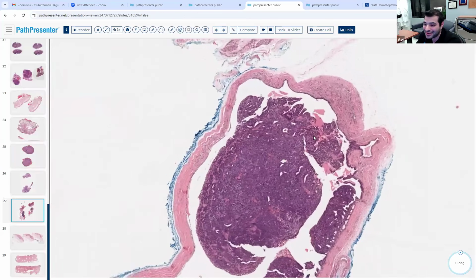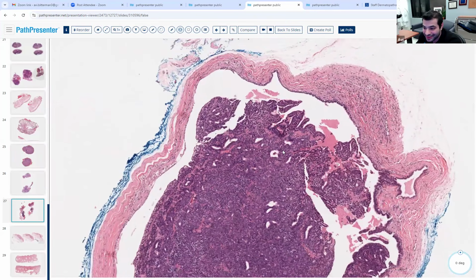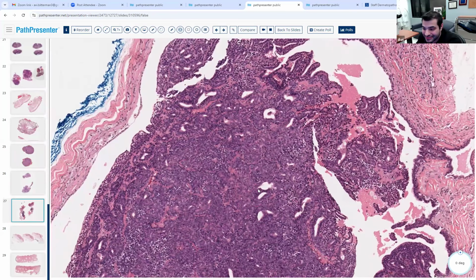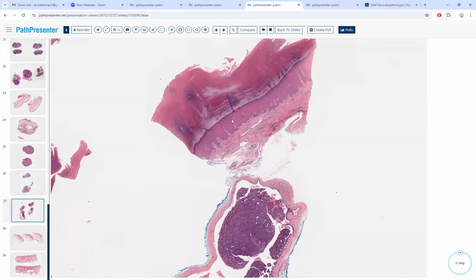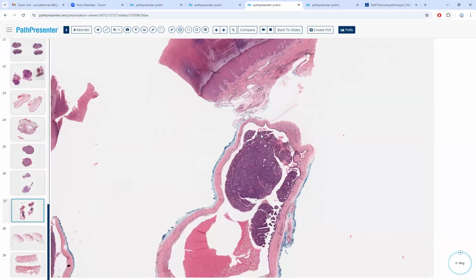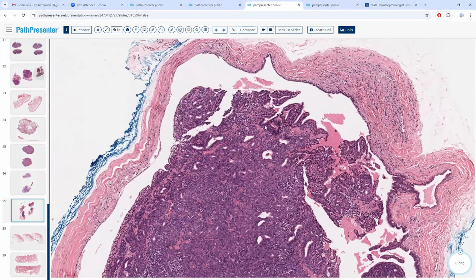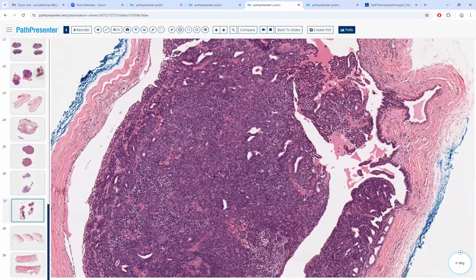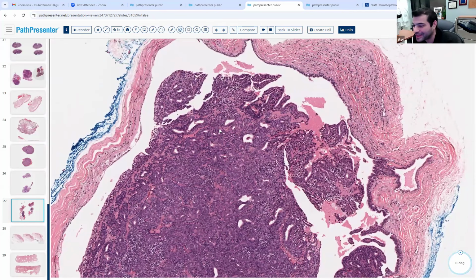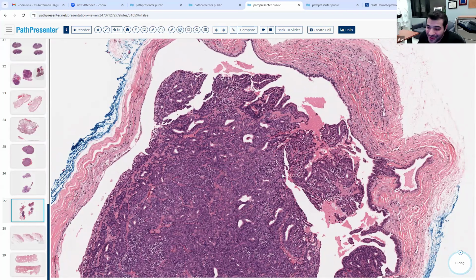Someone may have mentioned this, but we also have this papillated neoplasm here. But where is it from? Volar skin. Okay. This person needs to lose their finger, unfortunately. I didn't quite hear you, you're a bit low on the mic. This patient unfortunately needs to lose their finger or toe. Yeah, this patient may unfortunately lose their finger.